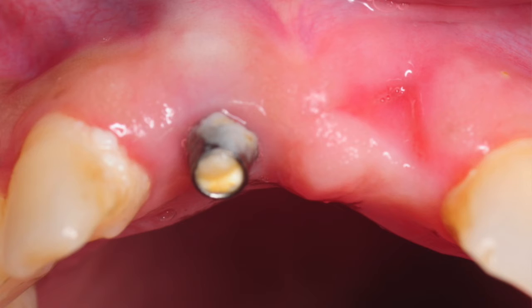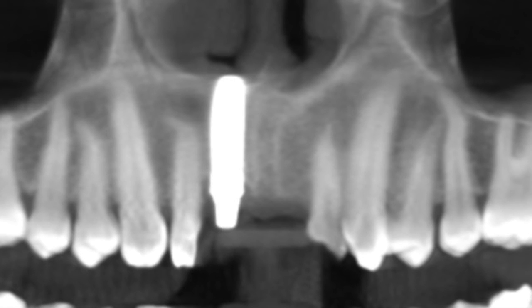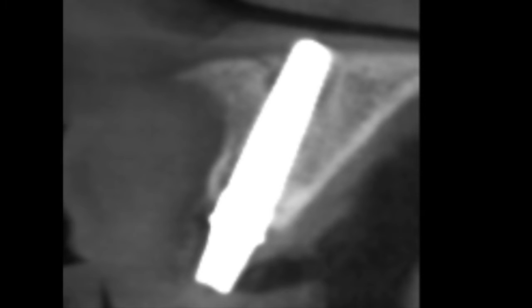This patient had this implant placed many years ago with non-specific facial pain and headaches since it was placed. The implant itself appears to have healed quite well with no signs of infection or inflammation, and the only significant finding was its perforation into the nasal floor, as the implant length was simply too long for the site. Although no direct relationship between the implant and her symptoms could be established, the patient elected to have it removed as a possible solution to her chronic pain.